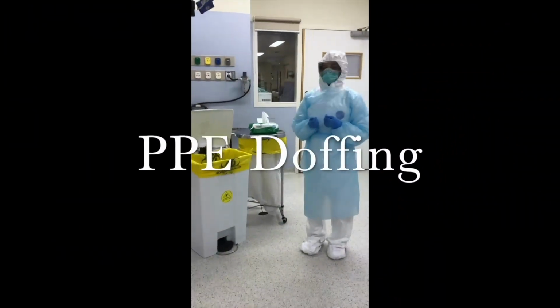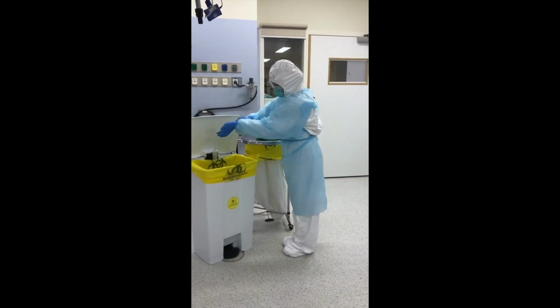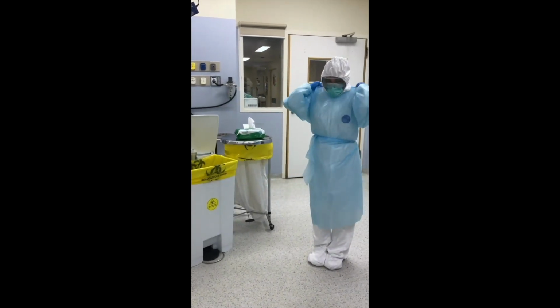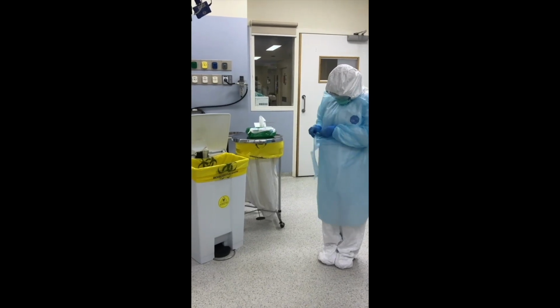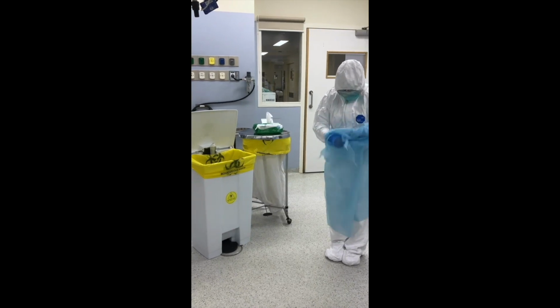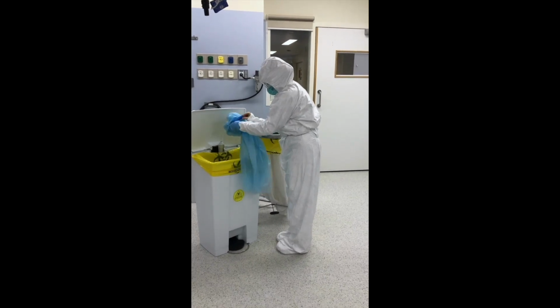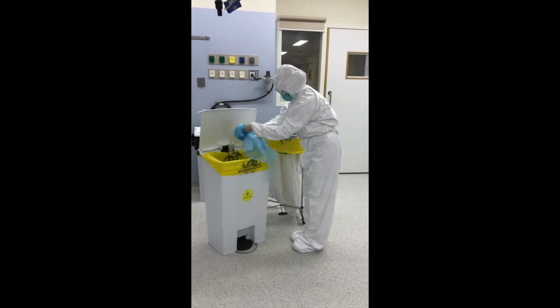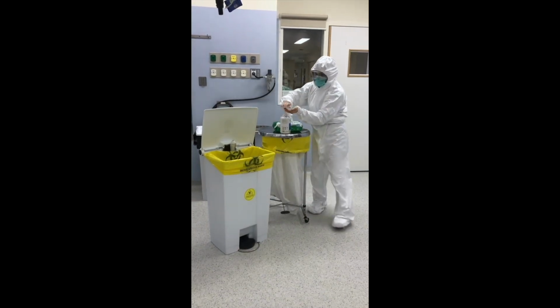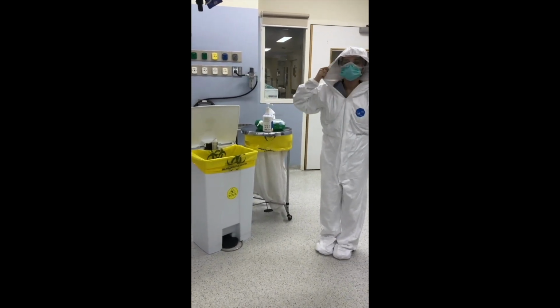So now we're going to describe removal of PPE. We're going to start by removing the outer set of gloves from outside till the inside. Next, remove the impermeable gown by tearing it from behind and folding it in. Take the inner set of gloves with it. Fold it and dispose it. Next, wash your hands with an alcohol-based solution. Remove the hood of the Tyvek and remove the whole Tyvek suit and dispose it.